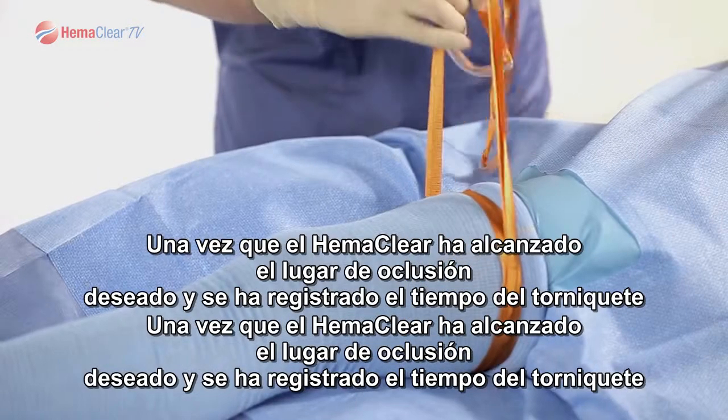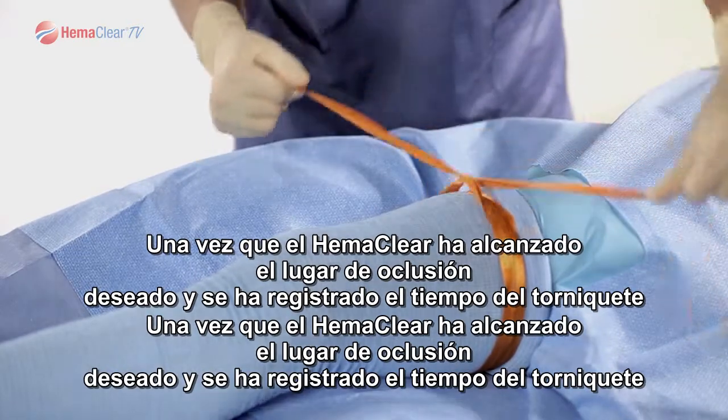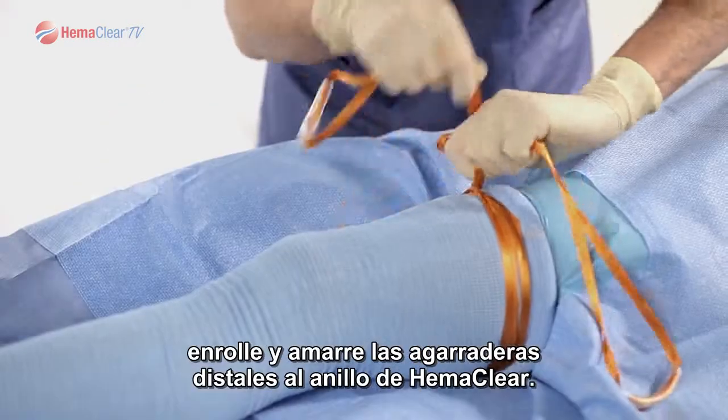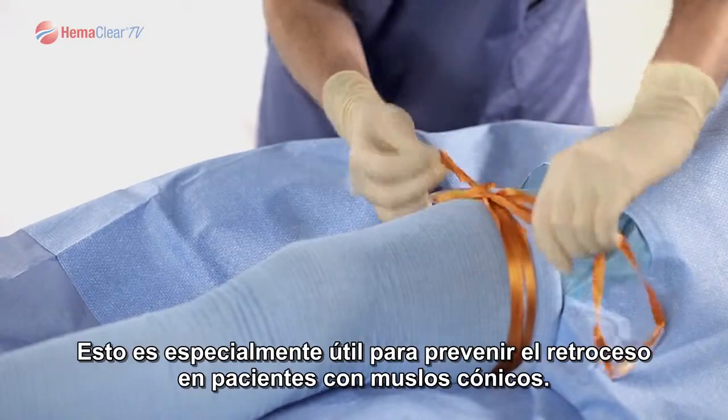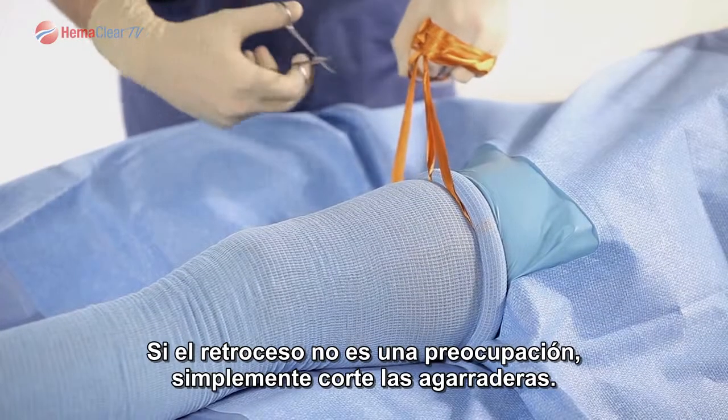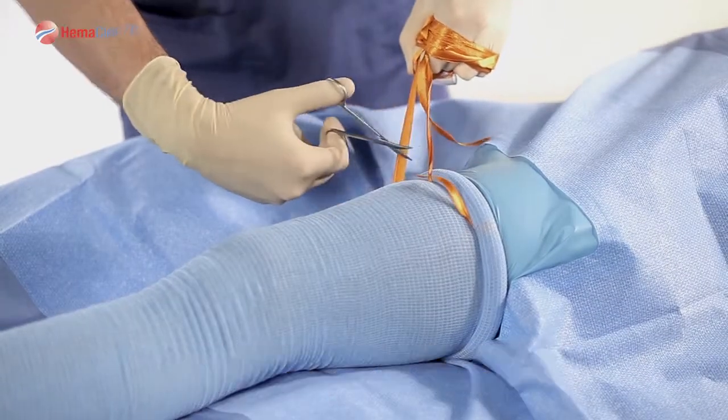Once HemaClear has reached the desired occlusion location and tourniquet time has been recorded, wrap and tie the straps distal to the HemaClear ring. This is especially helpful to prevent rollback in patients with conic shaped thighs. If rollback is not a concern, simply cut the ribbons off.